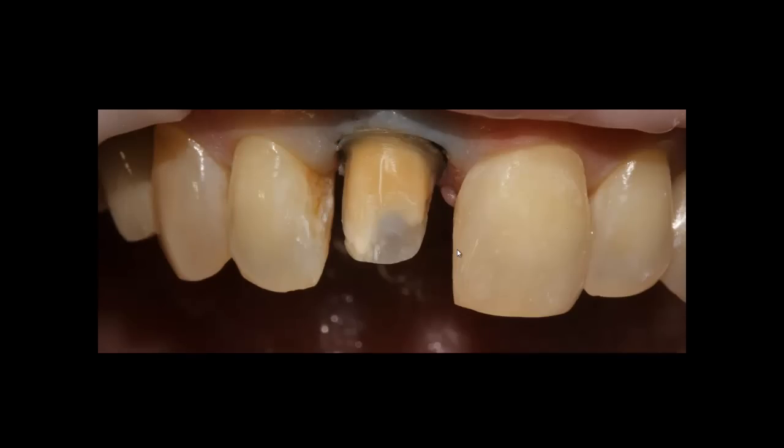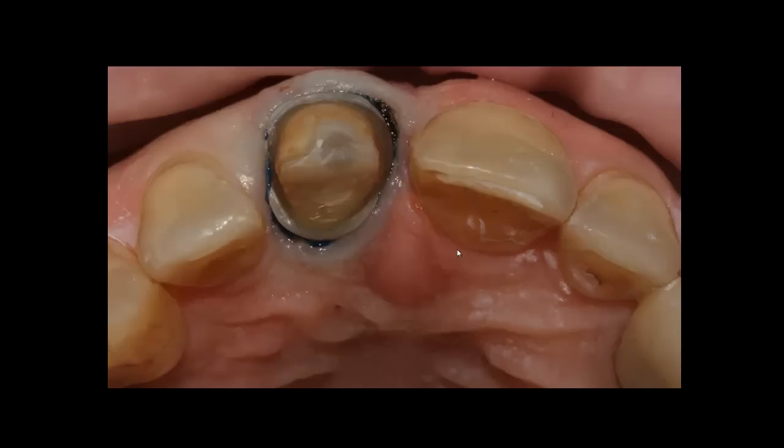This is the prep of the tooth. I removed the composite material from the lingual side, all the old restorative material from number eight, and also removed part of the old buildup sticking out on the coronal portion of the tooth. There was a lot of decay inside so I removed it, and there was a lot of discoloration so I did a little internal bleaching on number eight. I placed a fiber core post by Rely X and cemented with UniCem, then placed the core buildup and prepped the tooth. I also prepped a little bit down to the gingiva in the proximal area to close the black triangles between numbers eight and nine, and seven and eight.